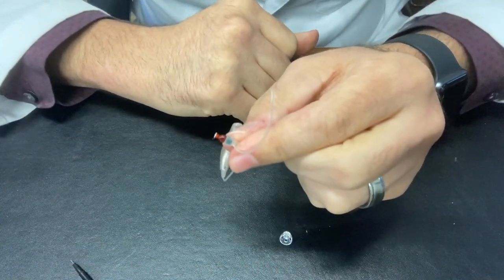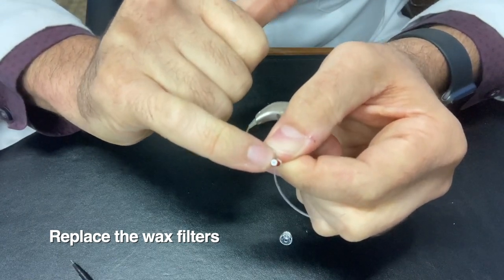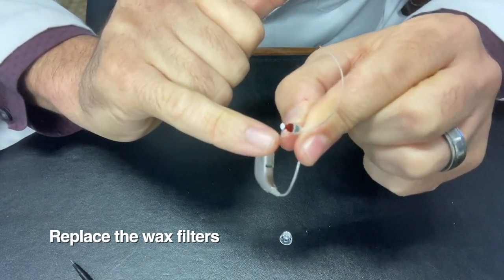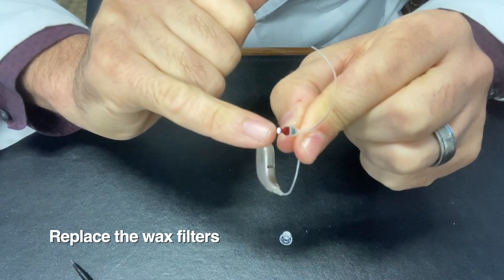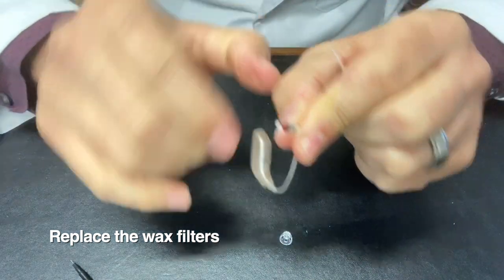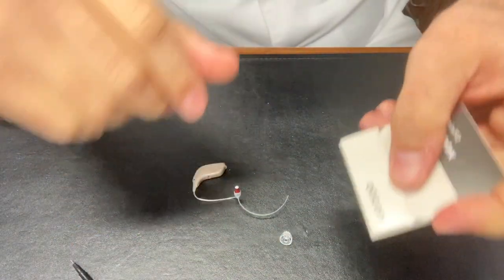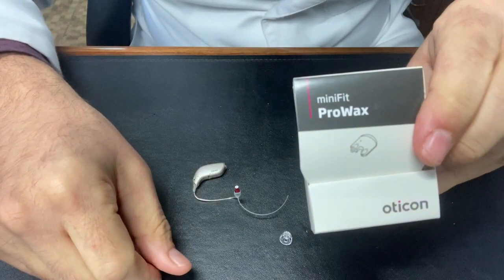The next thing we're going to do is change the wax filter. You can see this little white part in the end here, that white tip after we take off the dome. What we'll do is get some wax filters and open that up.